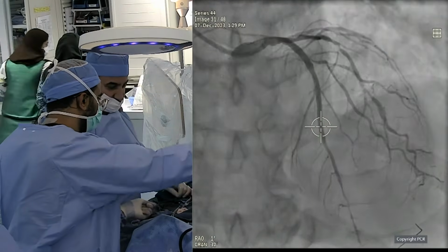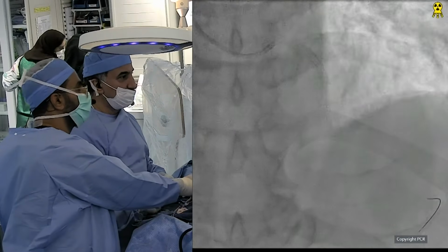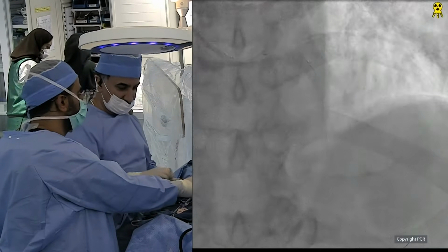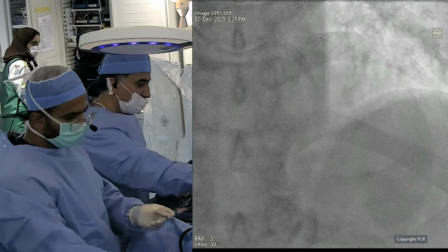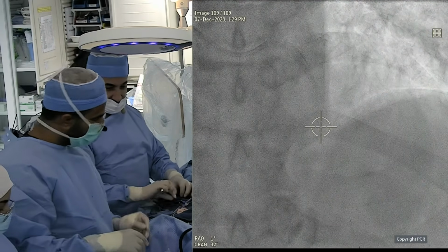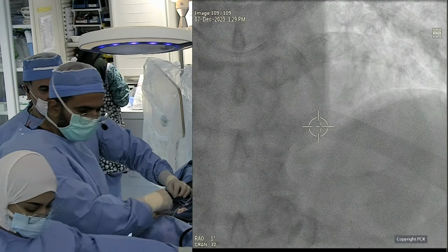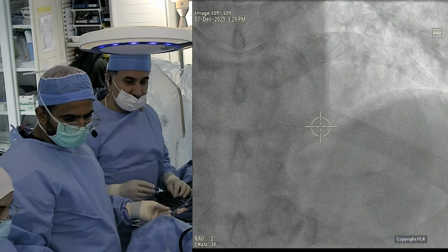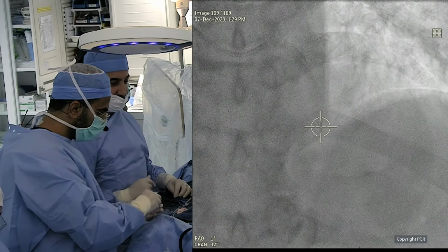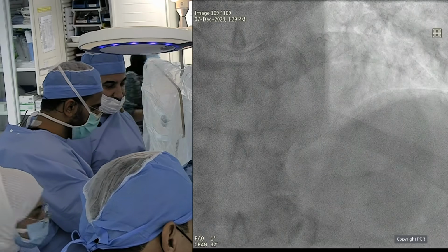Now the distal artery looks bigger, so maybe you want to do something about it. But I see your point, Andreas. We'll go back with the OCT to assess the result. So one question about the distal stent afterwards. It was not post-dilated with the non-compliant. Why not do it if you intended to do it now and then check with the OCT the optimization?